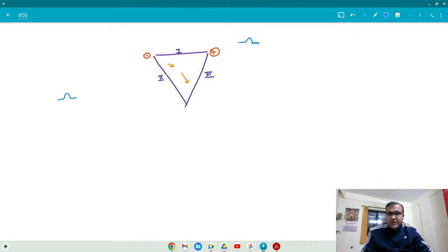Lead 3 magnitude seems bigger. Okay, so is this bigger, or do you think this should be bigger? But should it be positive or negative?